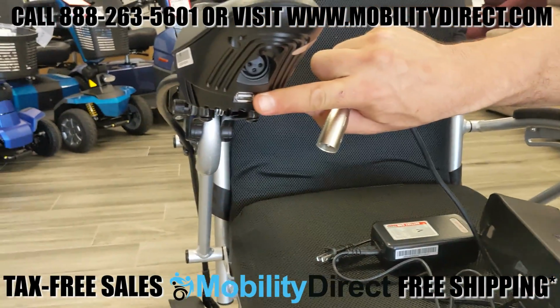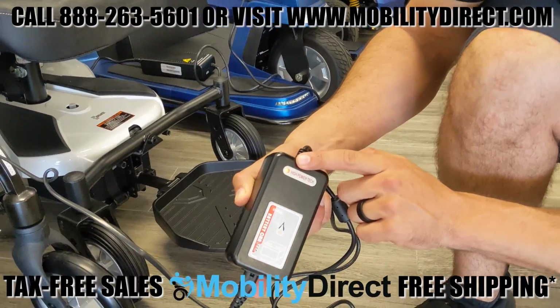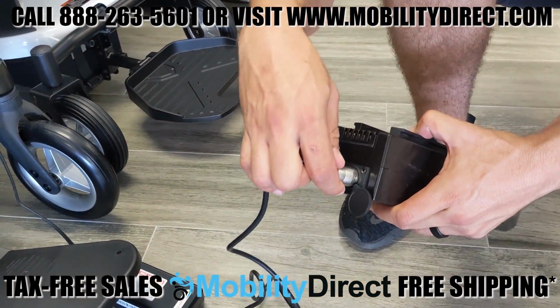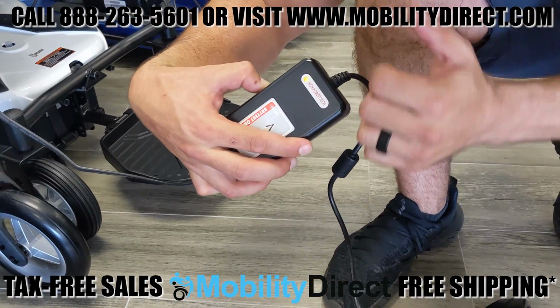You have two options. We just plugged the charger into the wall, and we can see the light is on. It does turn red when it's on, and then when you plug it into charge, it's going to turn yellow and eventually green when the battery is fully charged.